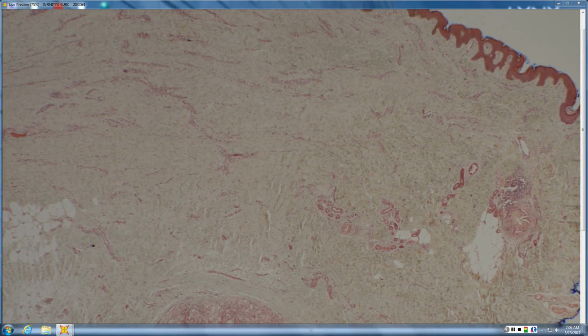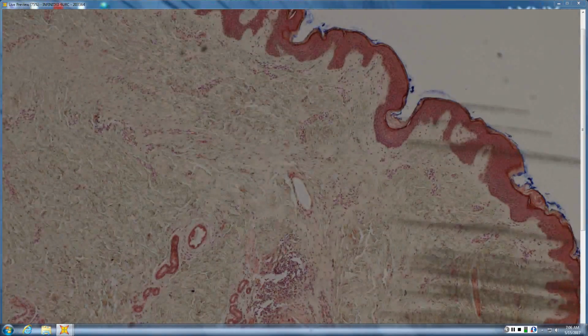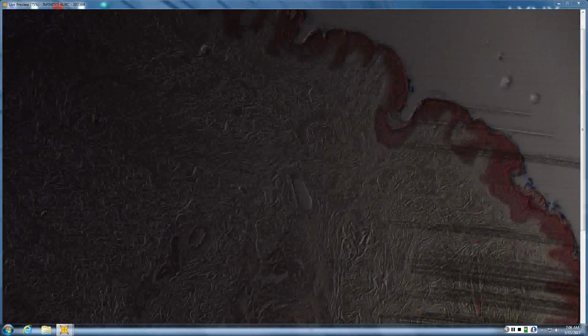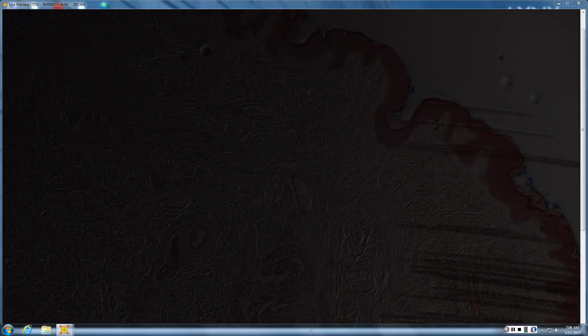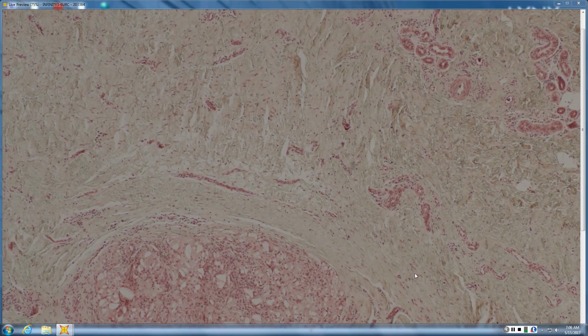And the slide is kind of faded, and I'm not going to actually polarize, but there's maybe some lighting up with diffraction. And especially with this little one over here, you can see that it looks almost like there's actual stuff in there that's sort of polarizing. So this is suture granuloma. Sometimes the suture can be very well pronounced and have that bluish color to it and everything. So yeah, suture granuloma. Not that exciting.